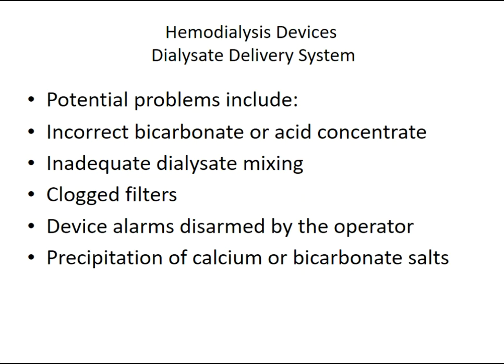Potential problems in the hemodialysis dialysate delivery system could harm the patient, including incorrect bicarbonate or acid concentrate, changing the pH of the fluid, inadequate dialysate mixing, clogging in the filters, device alarms disarmed by the operator, and precipitation of calcium or bicarbonate salt inside the hemodialysis machine.